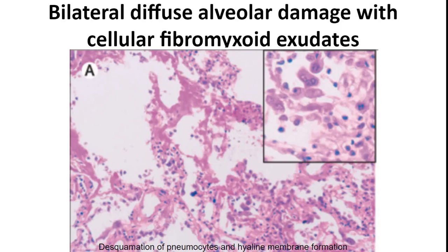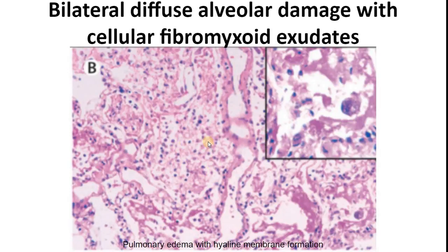On histopathology, we can see typical signs of ARDS: there is diffuse alveolar damage with evidence of pneumocyte desquamation, edema, and hyaline membrane formation. There is also interstitial mononuclear inflammatory cell infiltration and the formation of syncytial cells, which coronaviruses are known to induce. Here is a second image demonstrating the edema, the inflammatory cell infiltrates, and some of the hyaline membranes.